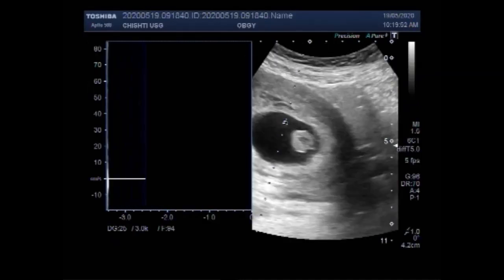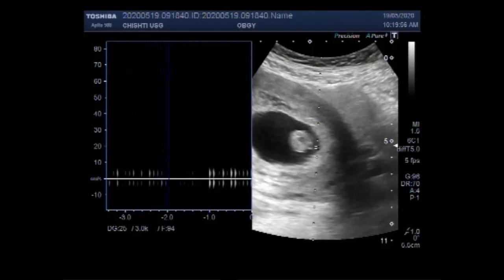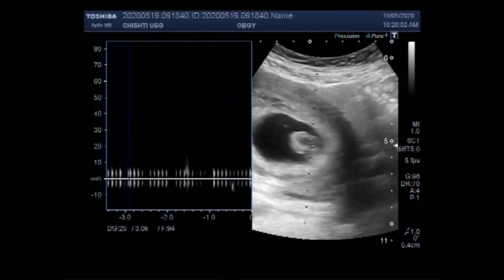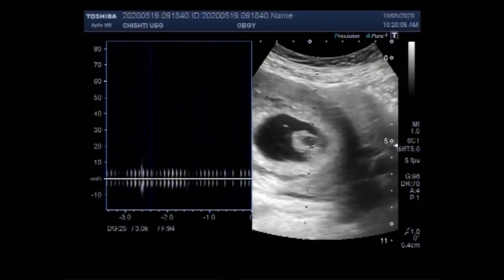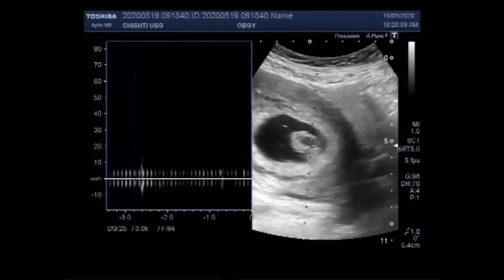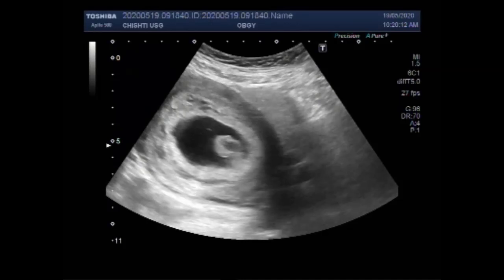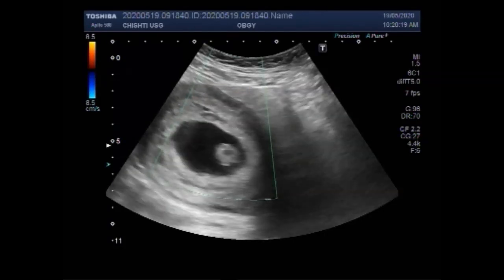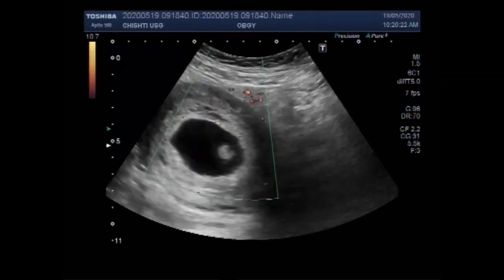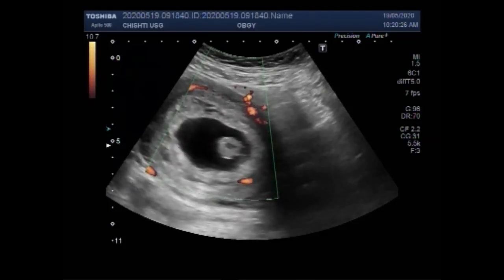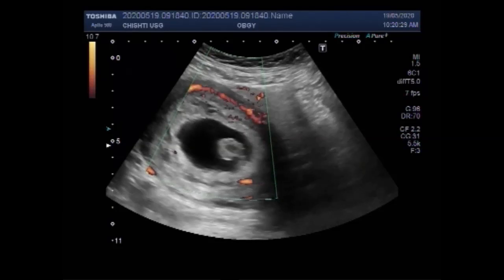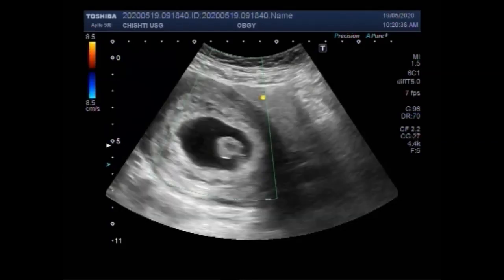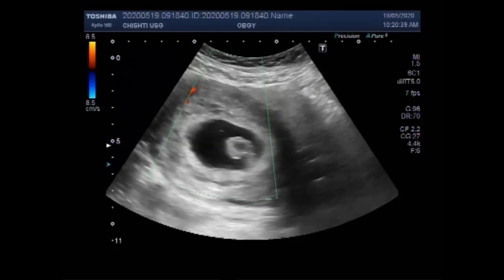You can see there is no cardiac activity seen in the fetal pole and there is no blood flow seen inside the gestational sac. Blood flow is seen in the uterus, but not in the gestational sac, and there is no cardiac activity visible inside the gestational sac or in the fetal pole.